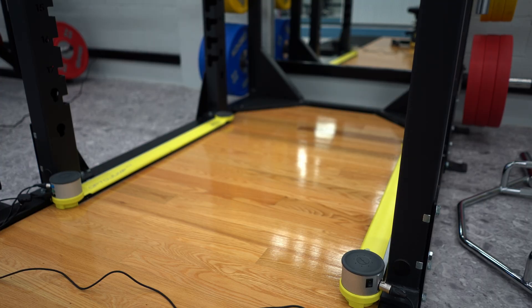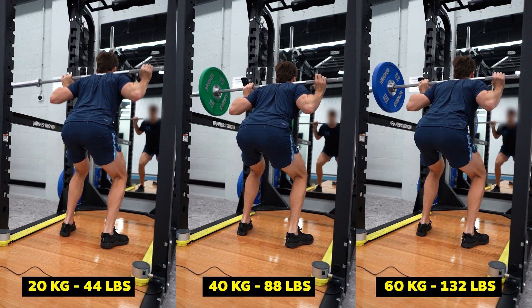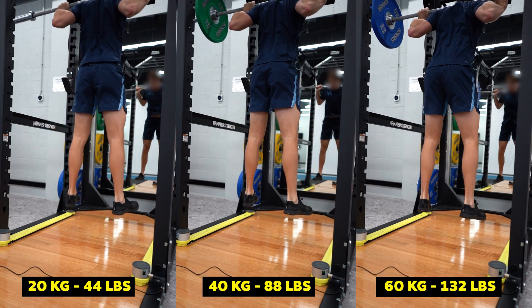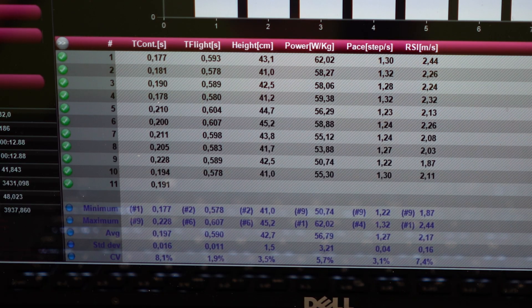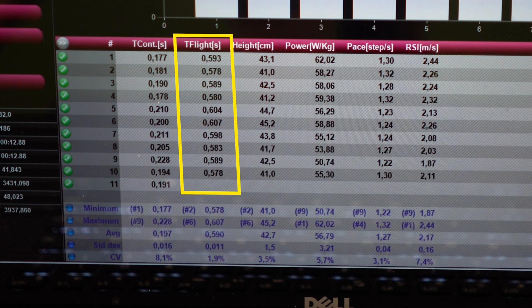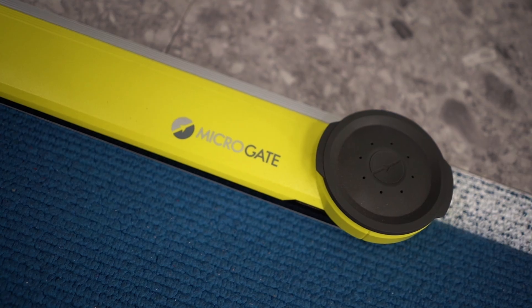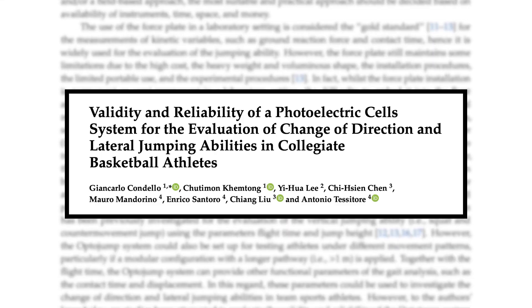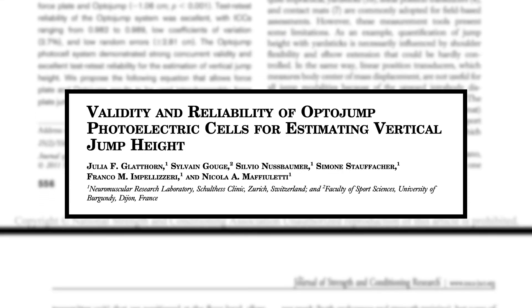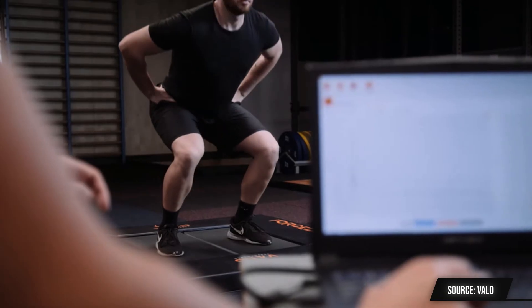You can even place the OptoJump in the squat rack and do a full jump testing protocol with increasing weights to create a force-velocity profile. Everything jump-testing wise — ground contact times, flight times, jump height, and reactive strength index — can all be measured. The accuracy and reliability of the OptoJump has even been scientifically researched and validated to almost perfectly match the gold standard of jump tests, that being force platforms.